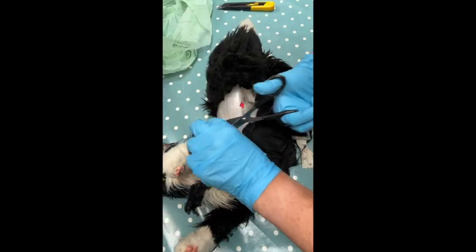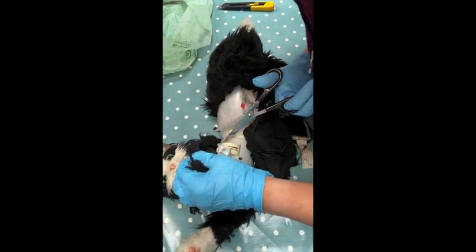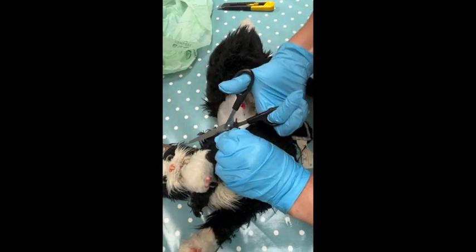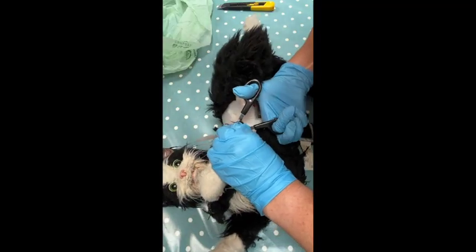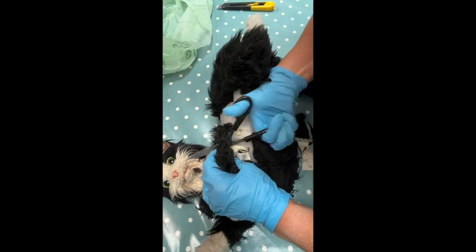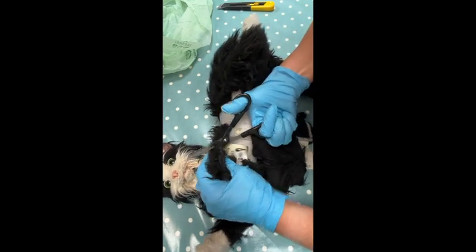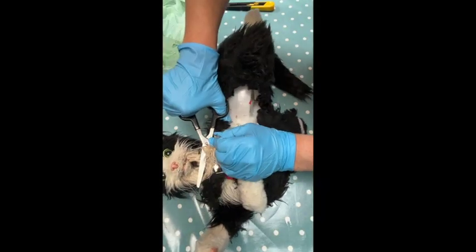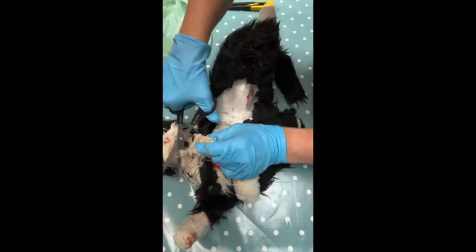Quite amazing. Oh, it's actually still working as far as I can remember. Actually, it's broken. Yeah, it looks like it's been broken there. Okay, getting closer. I do feel terrible cutting up a cat. My doctor thinks that I look like a vet at the moment. I told her I was doing a biopsy.